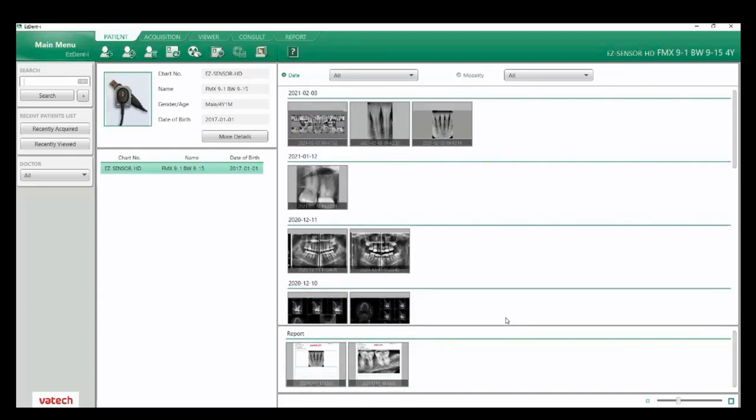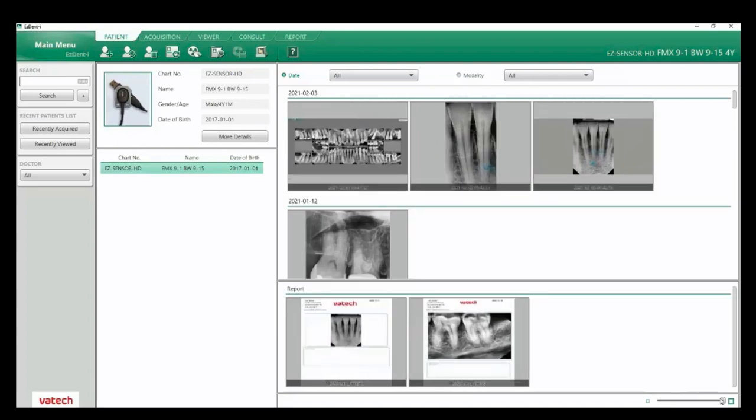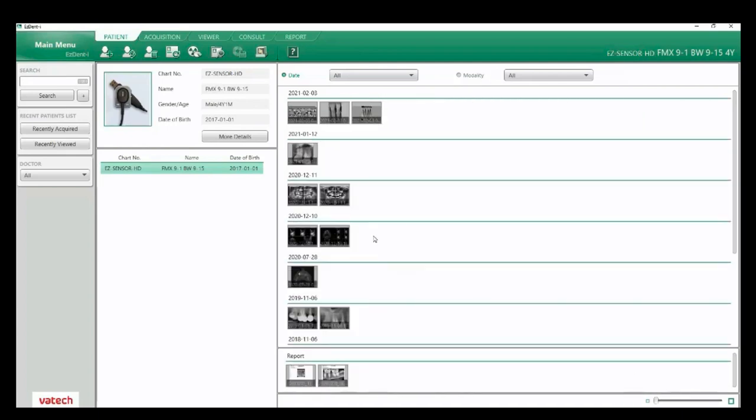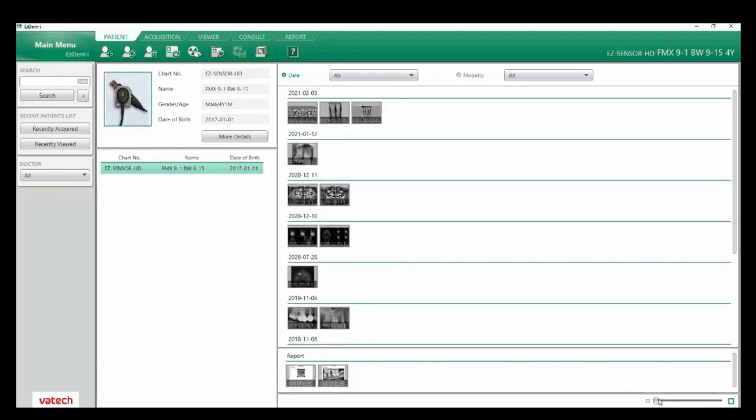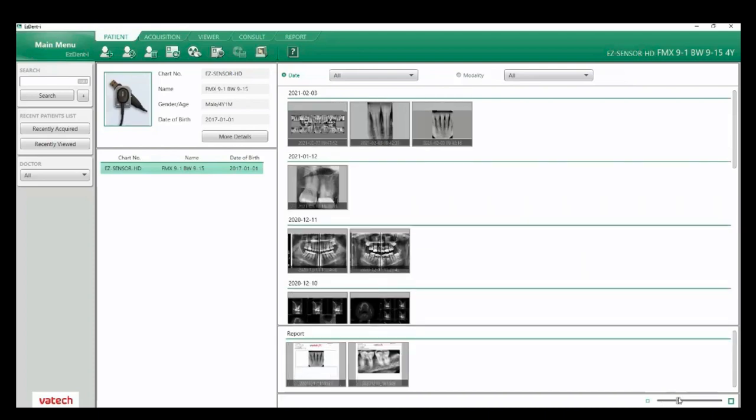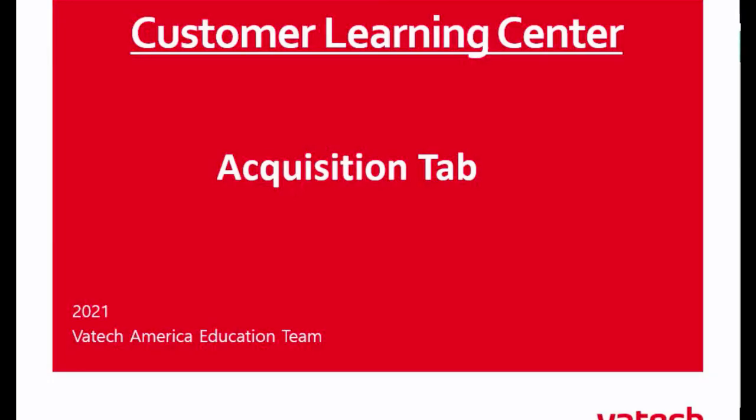At the bottom I do have my reports. Off the lower right I can enlarge images or minimize this down to show our full suite of images in a smaller format. Let's navigate over to our acquisition tab.